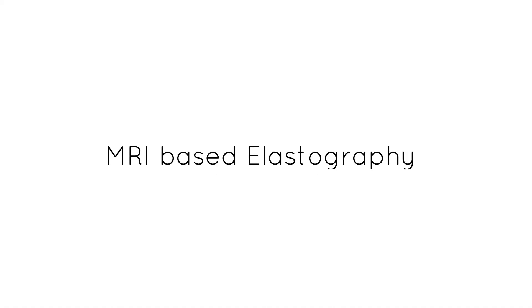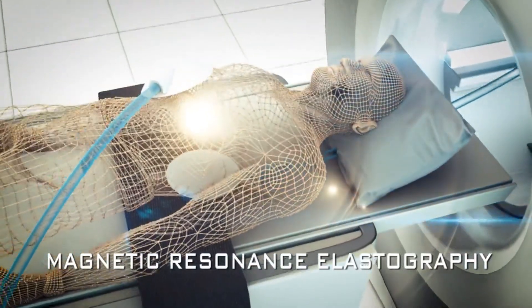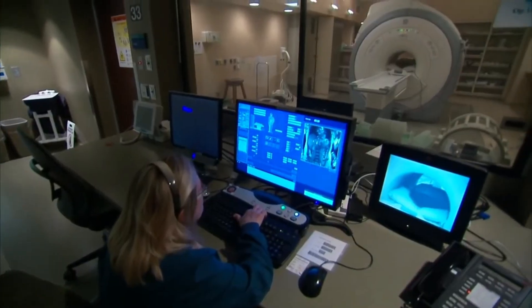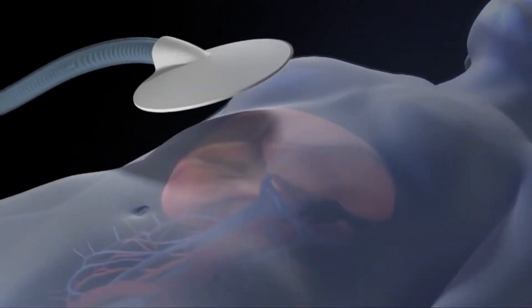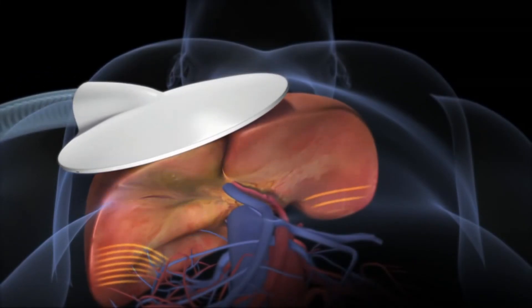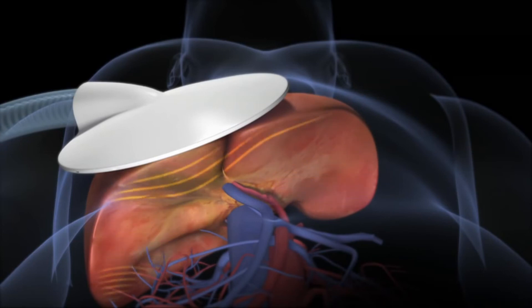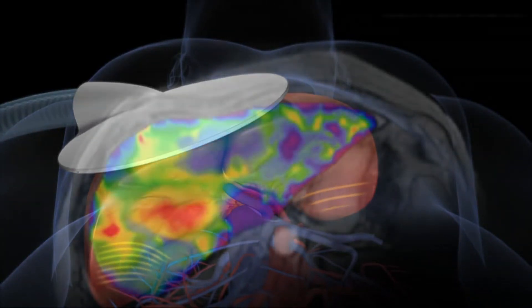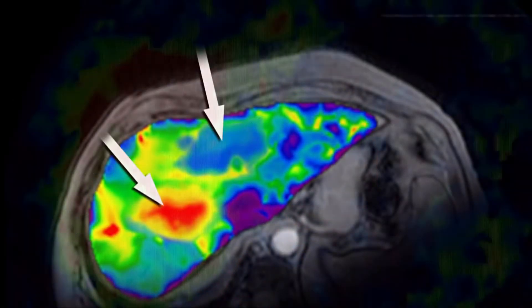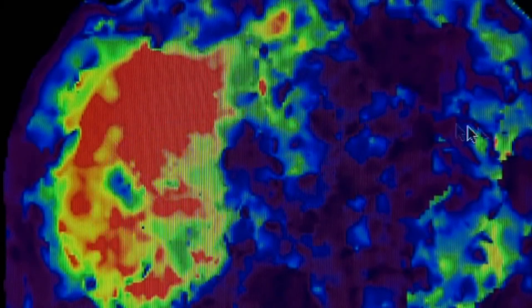For MRI-based elastography, an MRE examination is often done as part of a conventional MRI examination. A standard MRI liver examination takes about 15 to 45 minutes, and the MRE part takes less than 5 minutes. In an MRE examination, a special pad is placed against your body over your gown; it applies low-frequency vibrations that pass through your liver. The MRI system generates images of the waves passing through the liver and processes them to create cross-sectional images showing the stiffness of tissue.